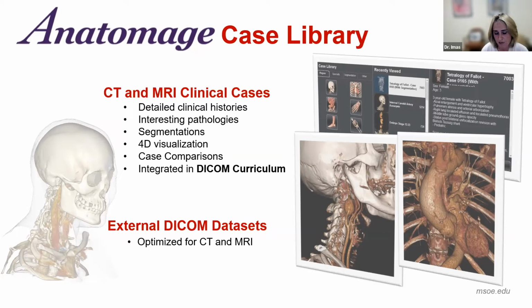The functionality is very well integrated within the table so that they pop up just like the built-in clinical cases. This feature is optimized for CT and MRI, but I did hear at the UGM you guys are working on, I thought it was ultrasound, if I'm not mistaken. So I'm hoping to see that in upcoming releases.